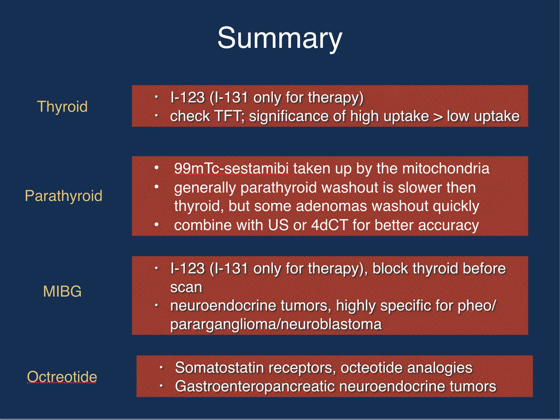In summary, we've talked about thyroid scintigraphy, where the only truly appropriate indication is abnormal thyroid function tests, and then we're looking for either no uptake, homogeneously increased uptake, or focal uptake of autonomous nodules. We've talked about sestamibi and using it to localize the parathyroid adenomas prior to surgery, although combination with ultrasound works much better, and now many centers are switching to 4D CT, or actually 3-phase CT.